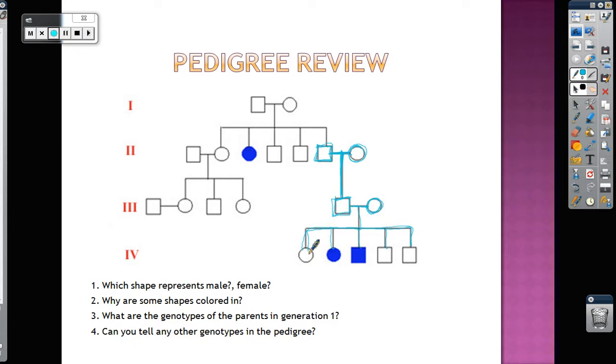That's how pedigree works. You're going to have to fill out a pedigree for some people and identify what blood type they have. Don't forget, we have 6 genotypes for 4 blood types. There's the big I, a little I, the heterozygous for type A blood, or the homozygous for type A blood. There's the same 2 for type B blood. Then there's type AB blood. There's only 1 genotype for that, and there's also 1 genotype for type O. So remember, divide those up, we have A, B, AB, and O. You're going to have to identify, based on your results of this blood typing lab, if a person's A, B, AB, or O, and you'll have to figure out their pedigree based on that.